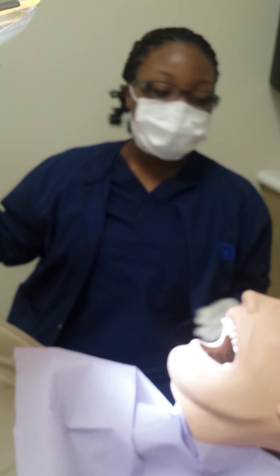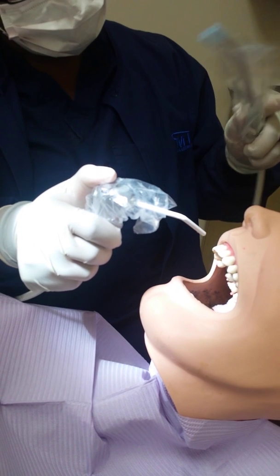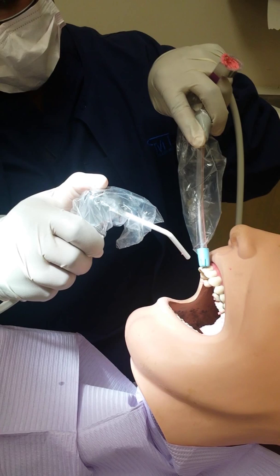Then you would use your water syringe to spray off any excess paste Dexter might have, so give them a good rinse.